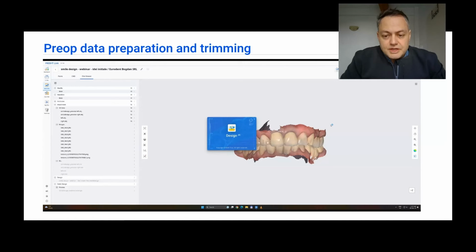We are going to design on that, and after we are finished with the design, we are going to merge the wax up with a second model with shallower pockets. Also, we are closing the model holes with gray color, so that we are going to be able to see where the outline of the teeth started from and where we did the virtual extractions, so that we generate teeth with the exact position as the previous extracted teeth at the margin line. And from there on out, we can do another geometry of the meshes.